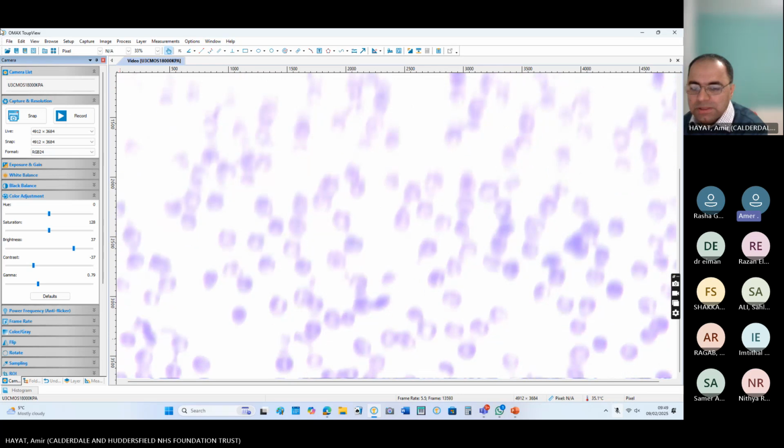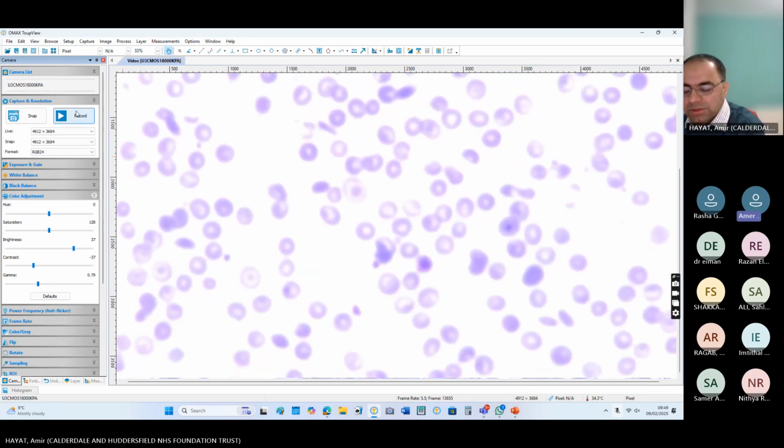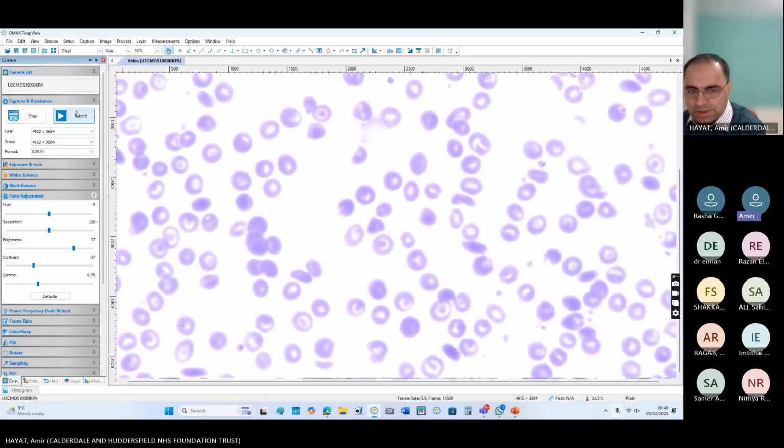And I mentioned this patient has dual diagnosis. These are two big Howell-Jolly bodies. That's why I was not commenting on the white cells. Usually such films with a dual diagnosis do not come in the exam. This patient has ALL plus sickle beta thalassemia.